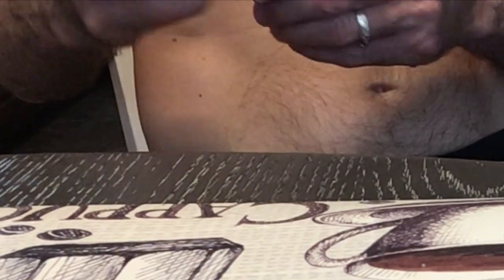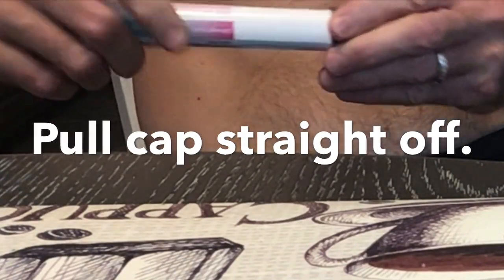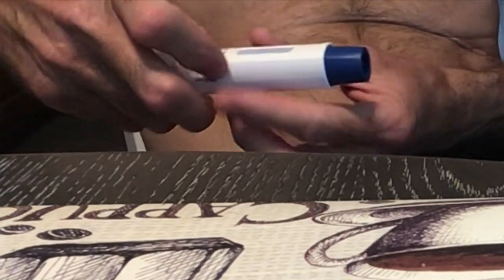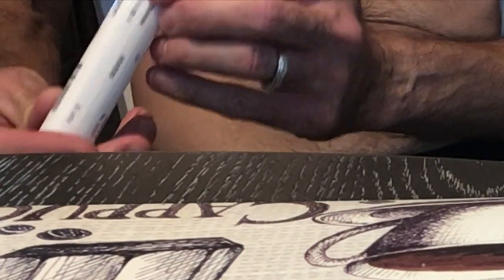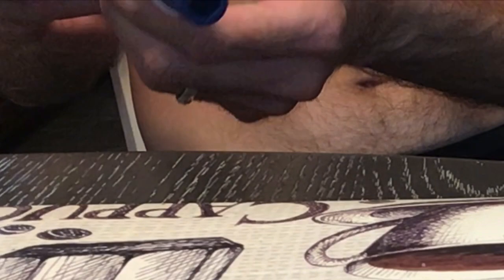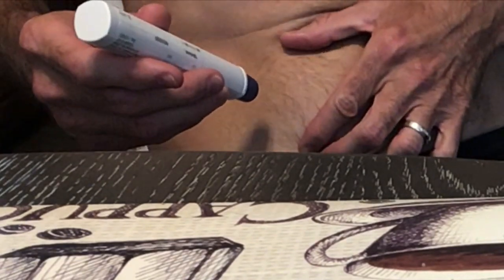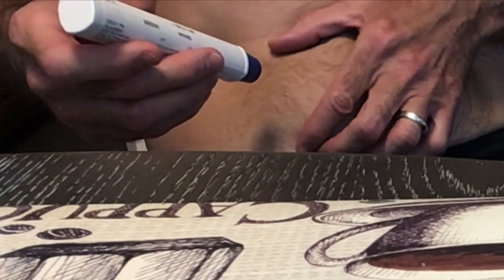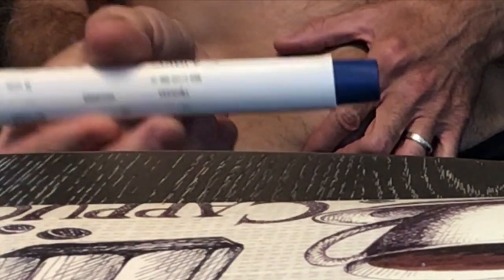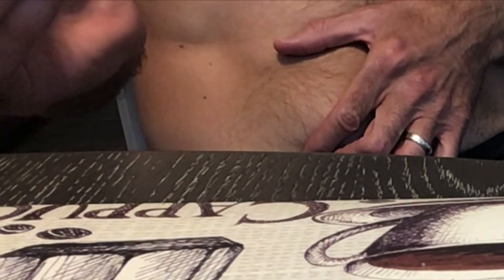What I'm gonna do is take the cap off — just pull it straight off. Inside there's a little needle. It's pretty small. Once you press this in, you don't want to pull it out. You also have to make sure that the liquid inside is clear and there's nothing contaminated.